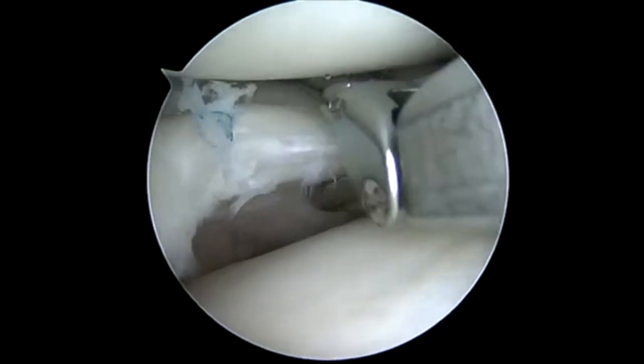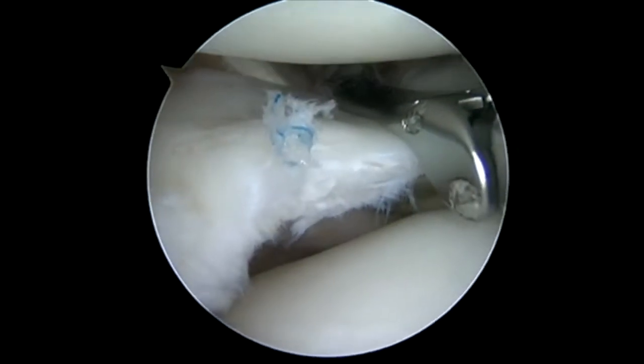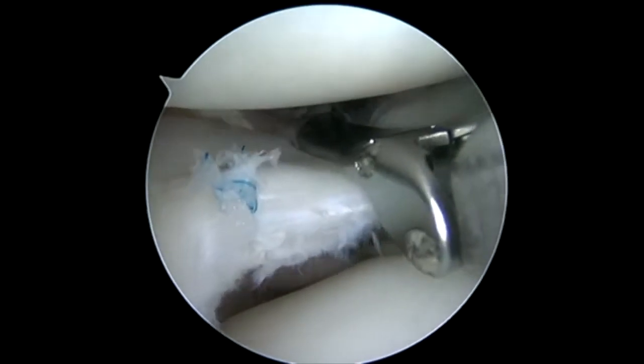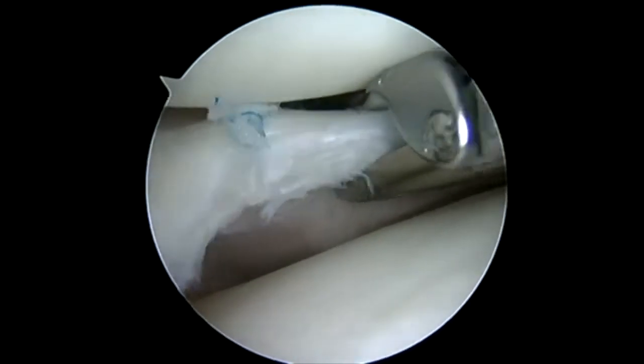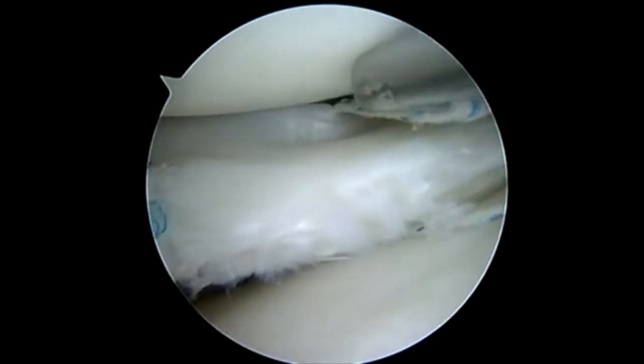We're going to place simple barrel stitches initially — one anterior of the popliteal tendon and one posterior to this. You can see the tendon in the background. By barrel stitches, I mean I'm just going to pass one limb of the suture, retrieve out the far side, and then tie over the edge.